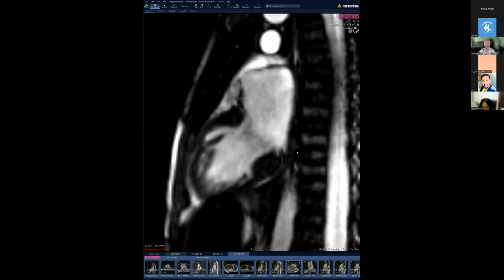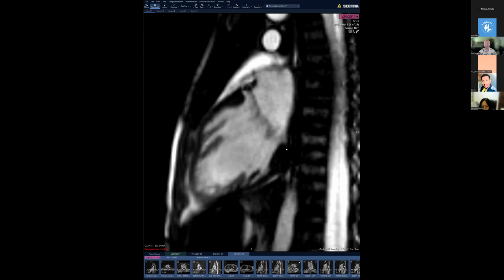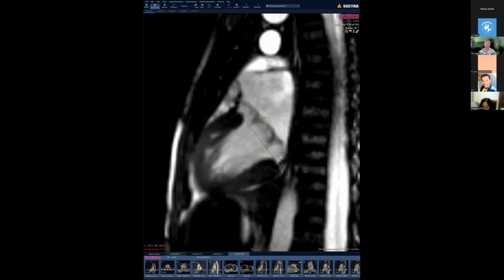Now, we have to be careful with this for two reasons. Some of the cardiologists don't like this diagnosis, and it's a debated diagnosis, so we need to be aware of that. And there are pitfalls also, because if the annulus is actually here and the leaflet just bulges out, it can give us this appearance where there is mitral annular disjunction. So it's important to look at the leaflets during systole carefully, whether they are actually starting here with the disjunction, or they're just starting here as they should, and it's a pseudo mitral annular disjunction.